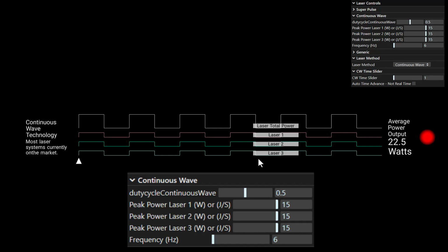Now, a lot of the lasers today have multiple lasers inside the machine. And they combine them optically, and then they come out one fiber optic cable out of the machine to a handheld piece to a lens. And then the lens is applied to the patient, either directly or hovering over a few inches or something like that. And it doesn't have to be on a movable handpiece. Some other ones are mounted on a machine that the machine either stays still or it rotates or moves in some way. But the energy has to obviously hit the person in order to do something. So the laser actually has to contact the skin, the light does, and that's the way that works.